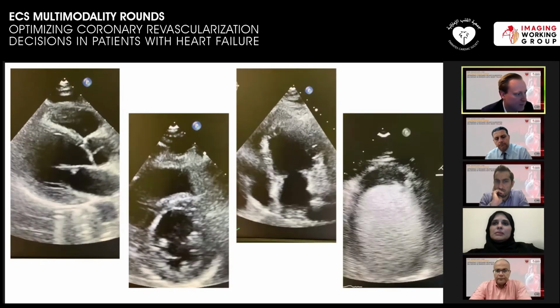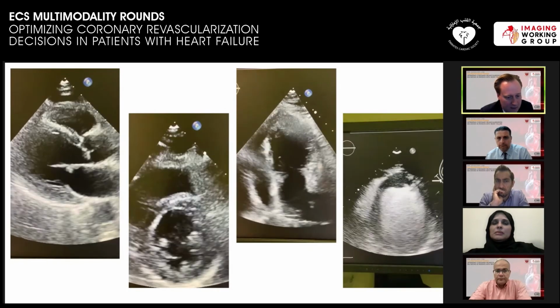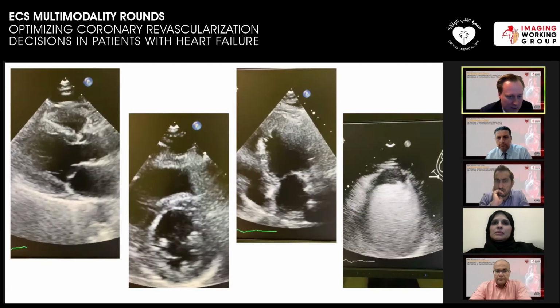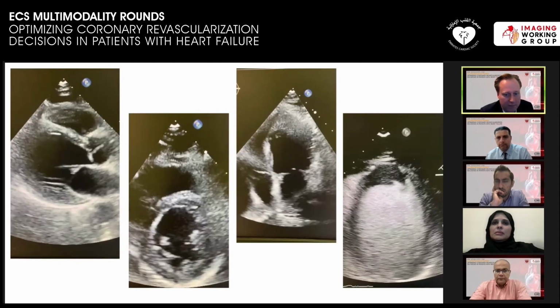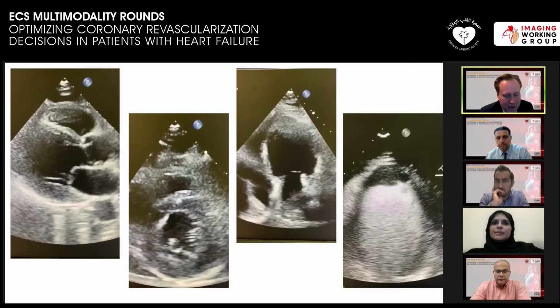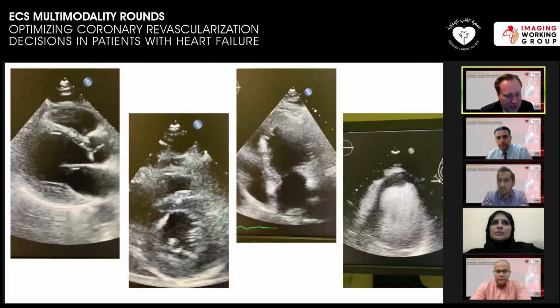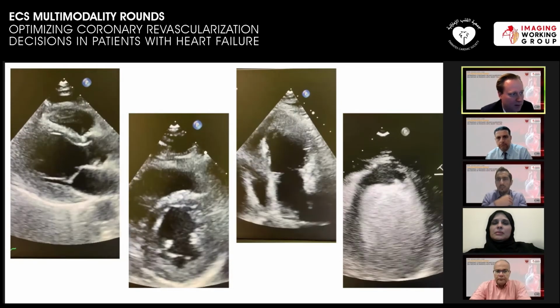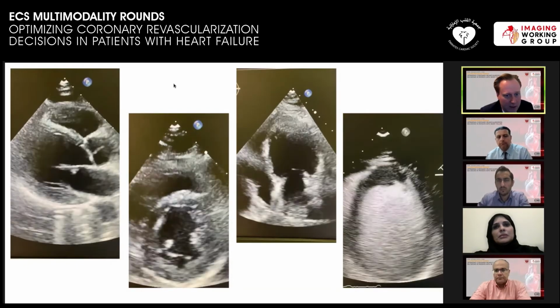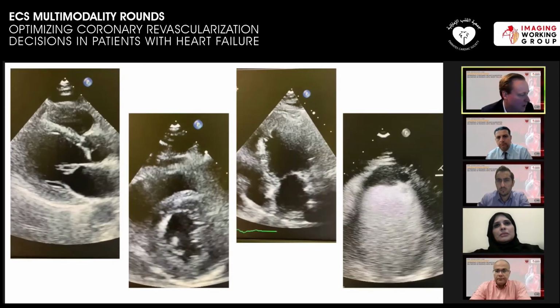an acute coronary syndrome. As it specifically relates to using PET, it can be problematic, because after an infarct, if the myocardium is inflamed, it may take up FDG. So we typically don't do FDG imaging after an acute infarct, because the pattern can be non-specific in terms of the changes in myocardial metabolism that are happening within the first couple to few weeks of the infarct.